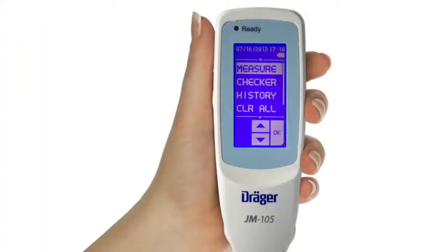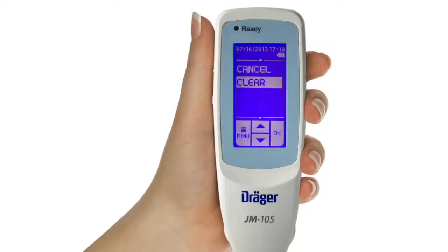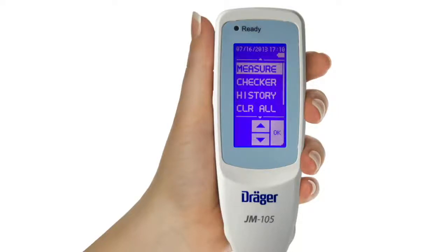To clear the history, go to the main menu screen and select Clear All. The display will then ask you whether you want to clear the history or cancel your selection. Select Clear. The display will ask you to confirm that you want to clear the data. Press OK, and the JM105 will clear the stored measurements.